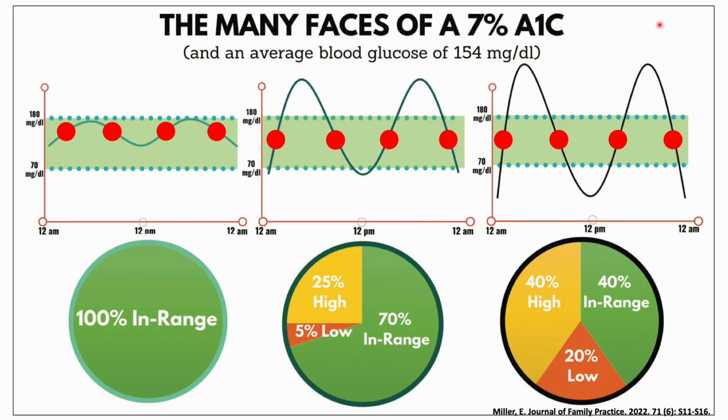To highlight what I said on the last slide even more, I want to spend some time on this slide because this really illustrates why CGM is so useful. Each of these panels, left, middle, and right, represents a different patient. Now, for many years, all we had to help patients manage their diabetes is an A1C and then a few blood sugar readings every day. And remember, A1C is an average of blood sugar readings over the last 90 days.